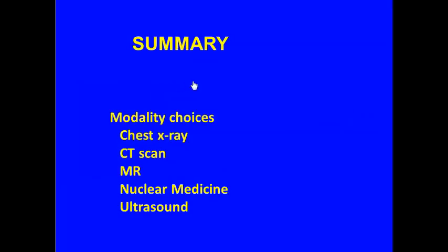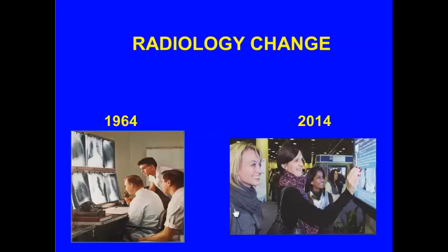And so that really summarizes our choices there. I think chest X-ray and CT scan are our major modalities, and then our other ones, MR, nuclear medicine, ultrasound, are probably secondary. So that kind of summarizes it.